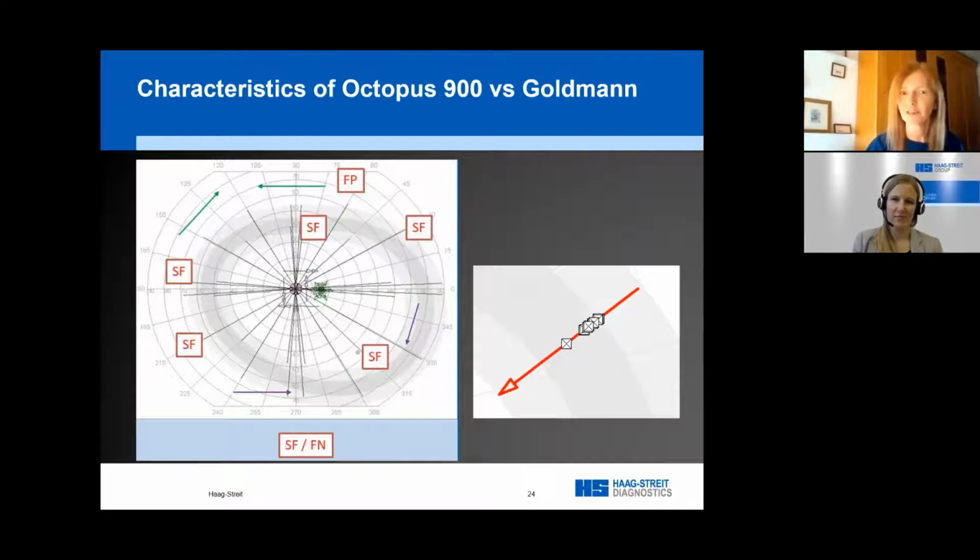I've mentioned before that the catch trials should be built in, including false positives and false negatives, and that shows quite nicely on this slide. That gives you a little bit more information about ensuring you've got repeatability.